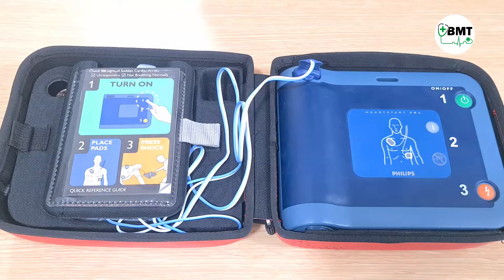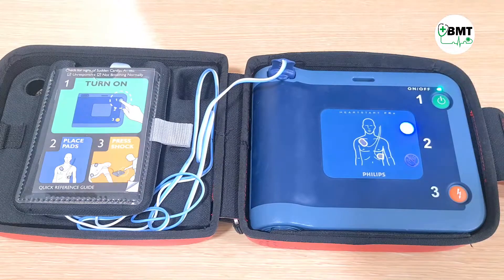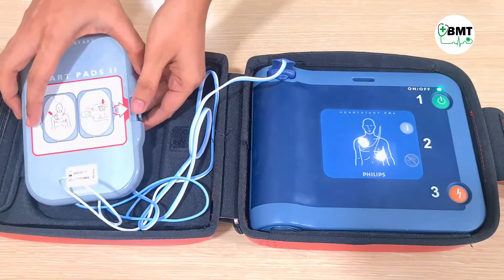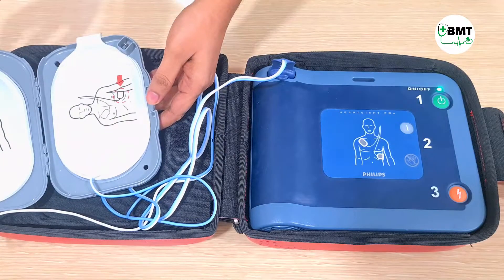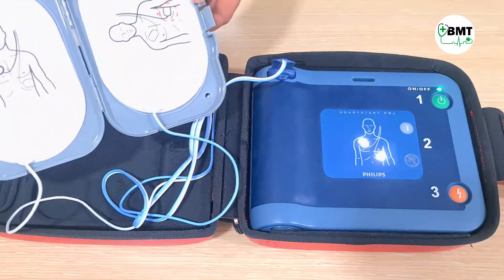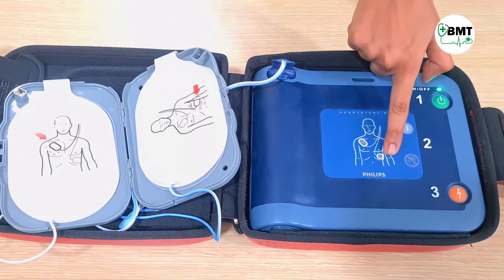Once this test is done, to use it, first press the on-off key and then follow the instructions. Remove clothes from the patient's chest. When the patient's chest is bare, open the gray plastic case and peel off the white adhesive pads. Look carefully at the pictures on the pads. Peel one white pad from the gray case and place it exactly as shown, pressing firmly to bare skin.